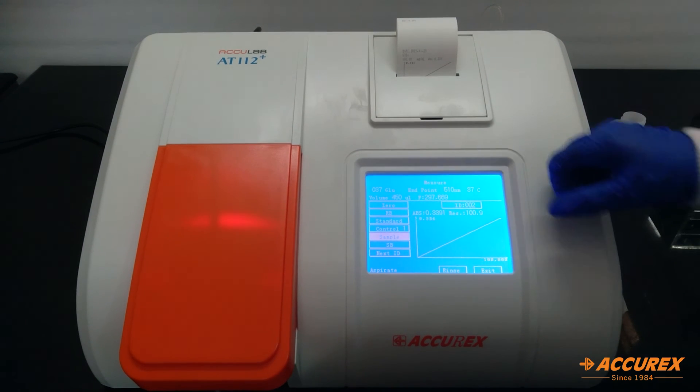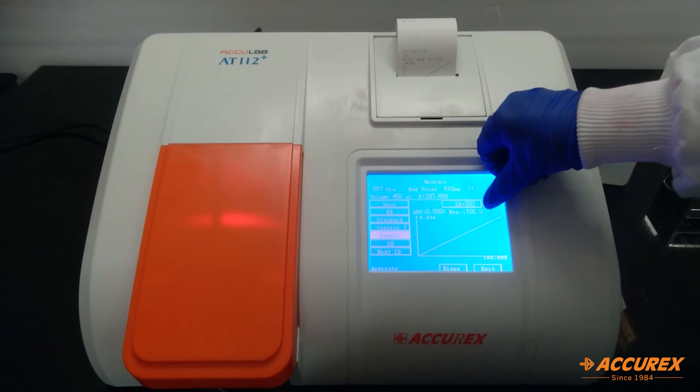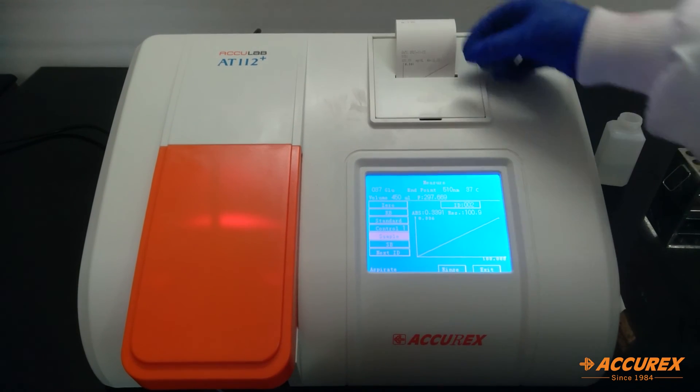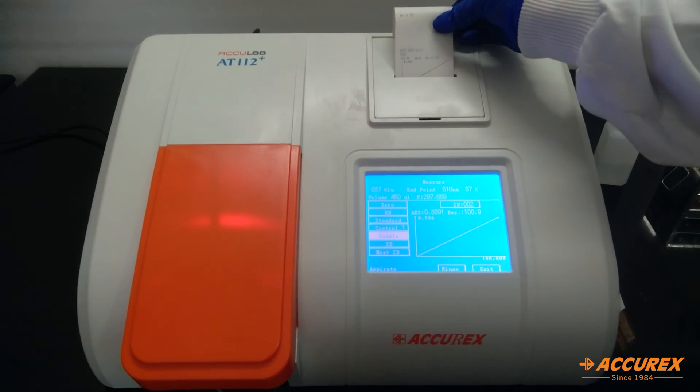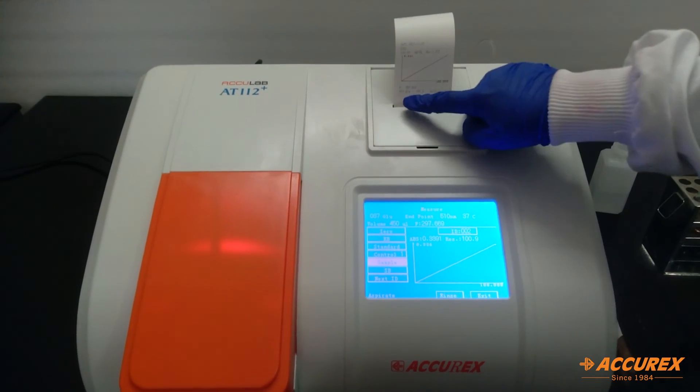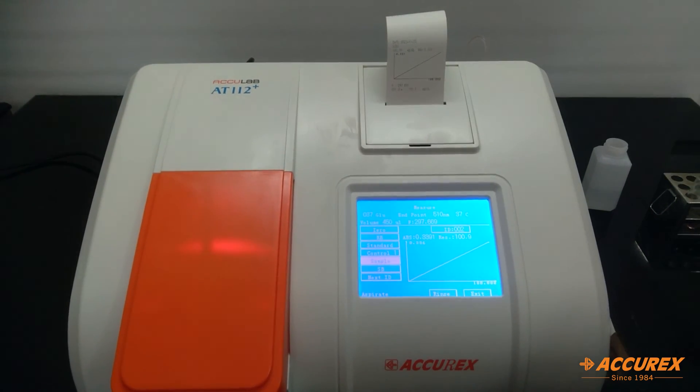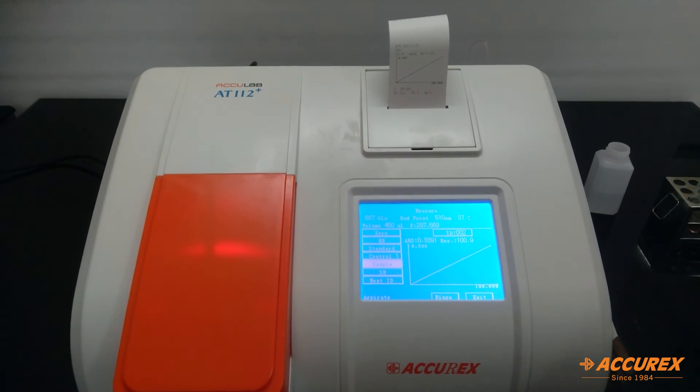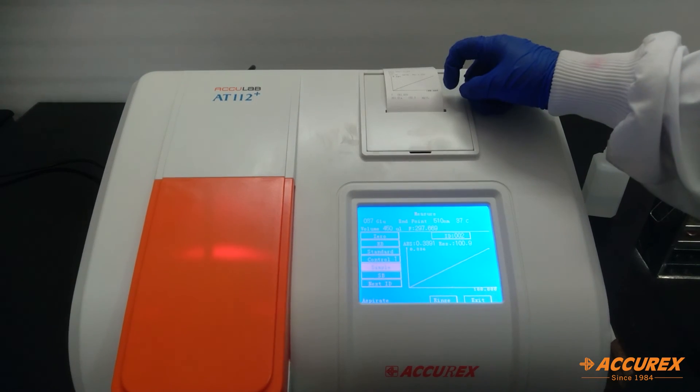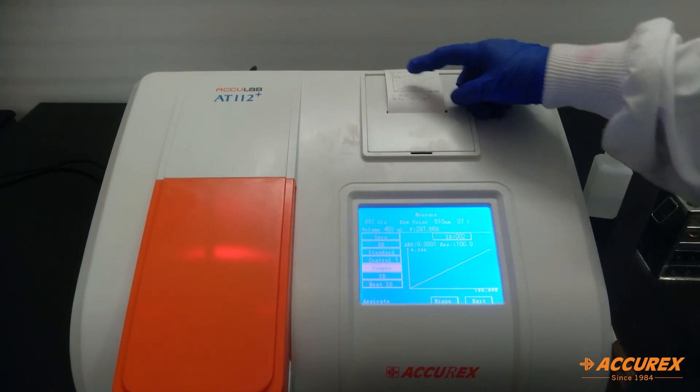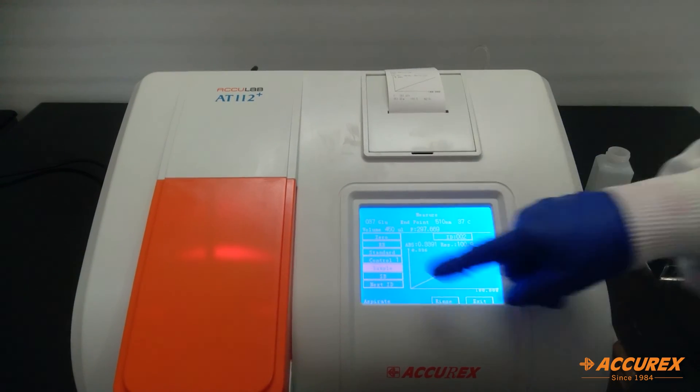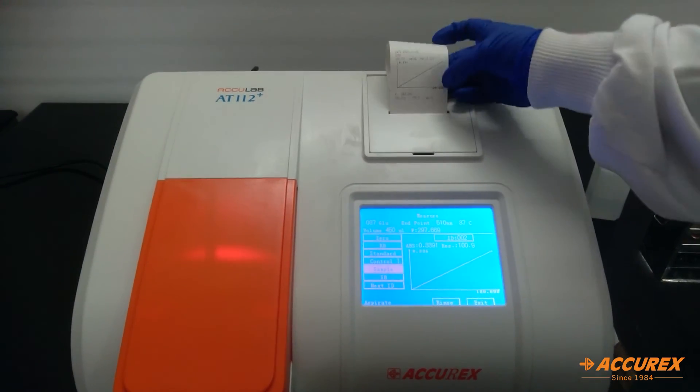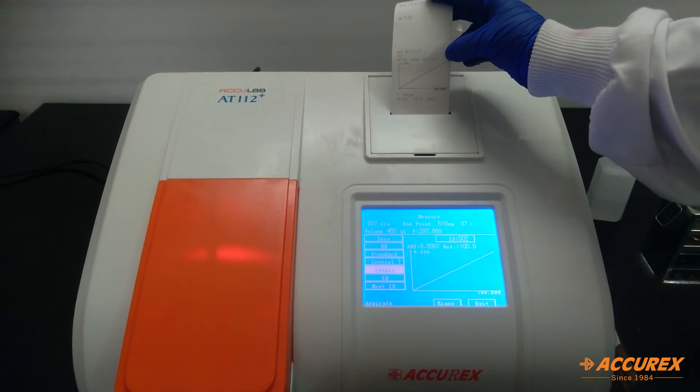Now we will give the sample. So this is the result that you will get, and on the printer paper you can see the result as well. This is the graph that is shown over here. It will also be printed over here.